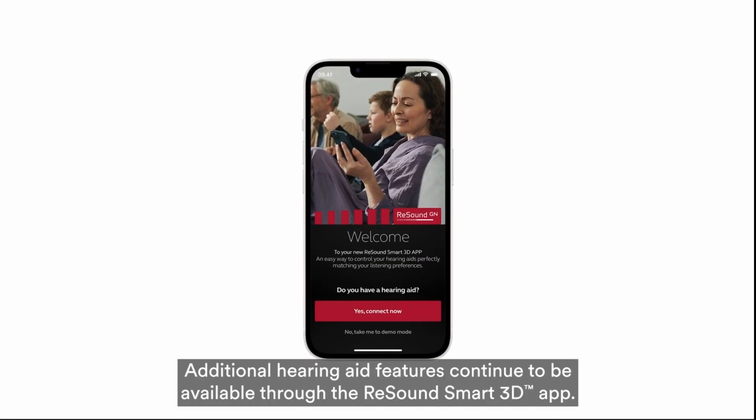Additional hearing aid features continue to be available through the ReSound Smart 3D app.